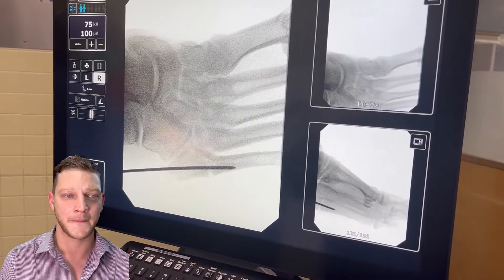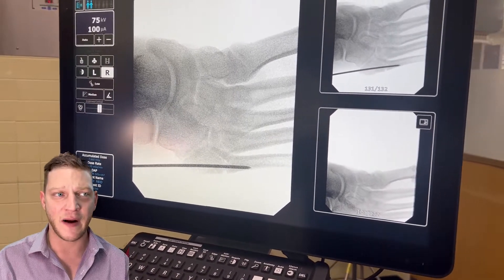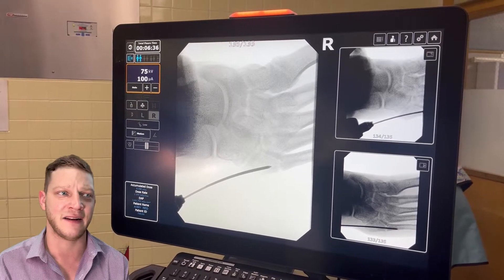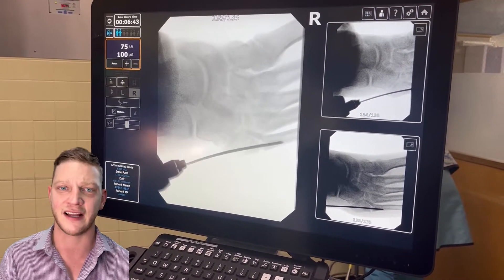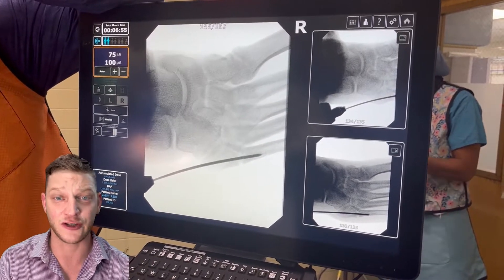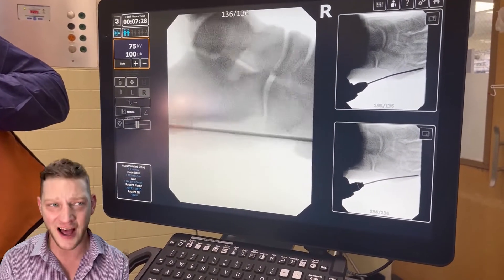It's a pain to retry. You can see the wire is a little bent — I'm bending the wire against the skin so that I can get the best aim possible. It sounds barbaric, but I'm hoping it bounces off the cortex. This is a sweaty procedure because you throw the K-wire so many times and you're worried about not getting the placement you want. With that small adjustment it looked like it was about to go in the right spot. Now on the AP it looks better — let's check the lateral.